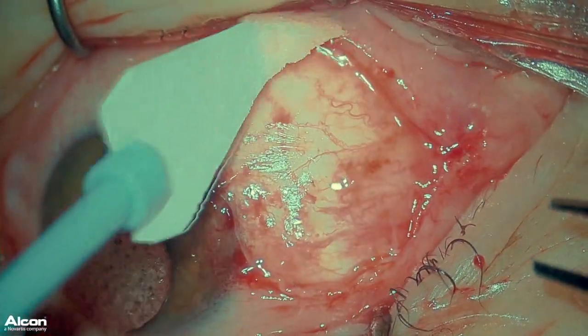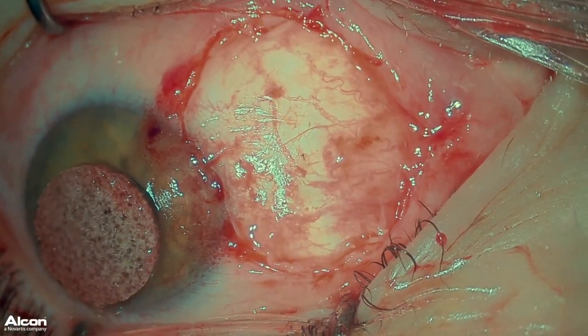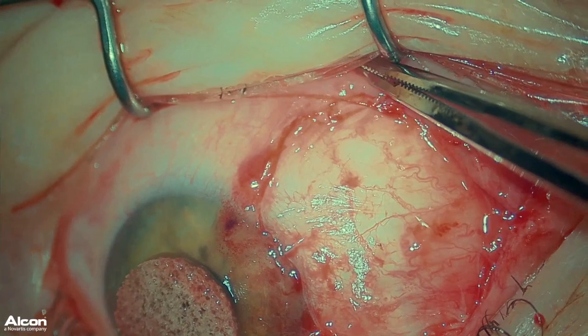I then use a Weck-Cel sponge to check for any attachments of the glue to the speculum. The last thing you want to do is remove your graft at the same time as removing your speculum after all your hard work. I use a Vannas scissors to snip any attachments.